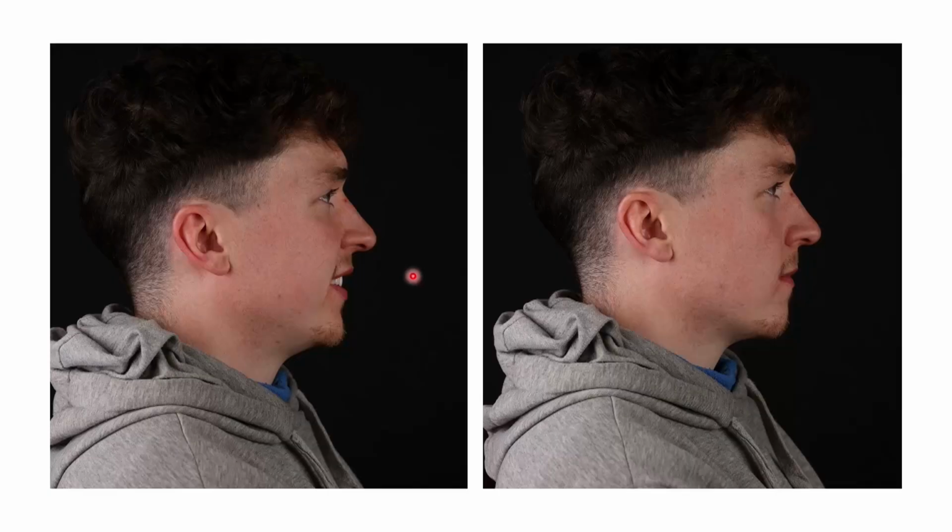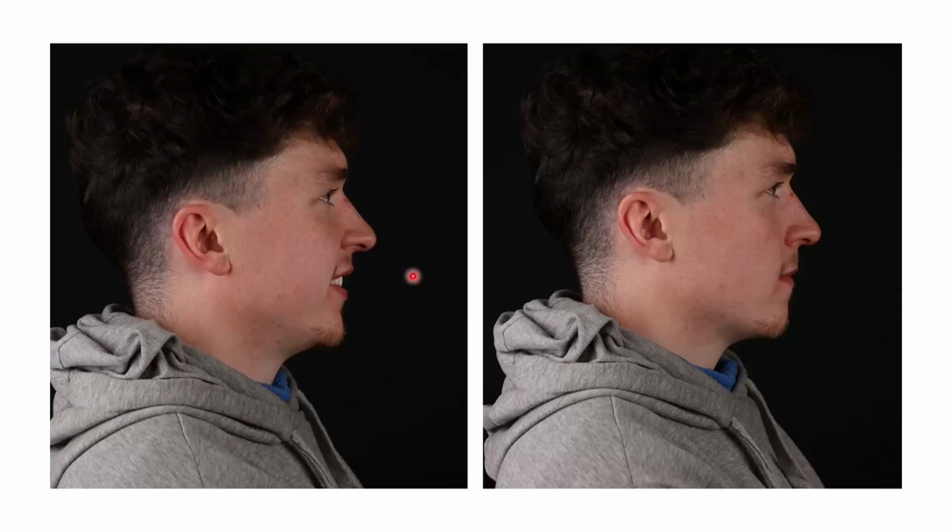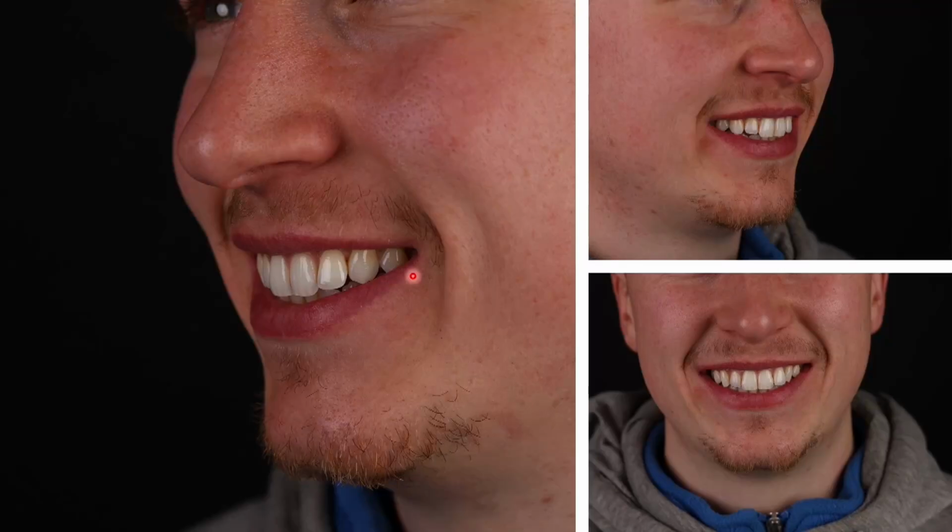Presenting issue here was the slightly outstanding upper left 2, and we had some mild crowding in the lower incisors. And we have here a nice profile, strong smile, strong jaw, and it passed all our tests for a simple case. It's ideal for clear aligning because we only want to really correct one tooth on the upper and some on the lower. And so we submitted this for an alignment plan.